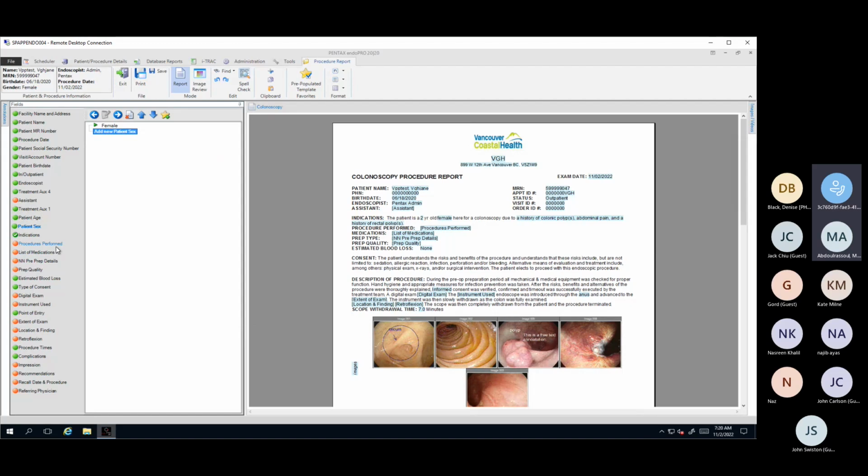Is that going to be modified? Because some people, if they ask for their reports and you say this is an undifferentiated. It would be a better question for CST. Yeah, okay. But I think it needs to be. I was surprised actually that it is what it is already. I would have figured they would have changed that by now. I think it needs changing. I could certainly put the question, but I don't know the answer myself.